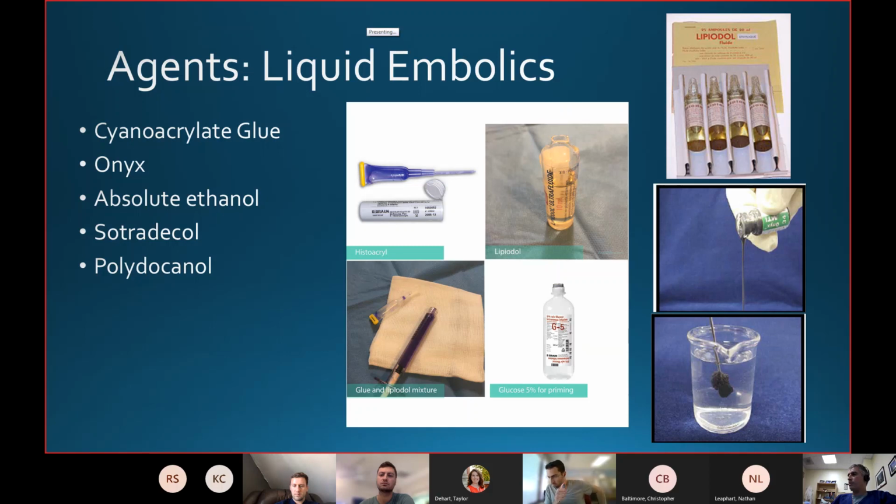If you use a large amount of it, sometimes back in Virginia we used to treat embolics with this stuff, and sometimes we used a lot of it, and the patients would smell like garlic for days, because when the DMSO is metabolized, it makes you smell like garlic for some reason. We don't really know why, but sometimes you walk into the room of a patient that had been treated with Onyx, and it would have this raging smell of garlic. It's kind of funny.